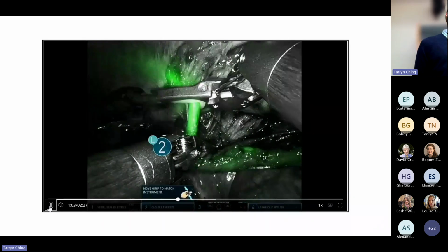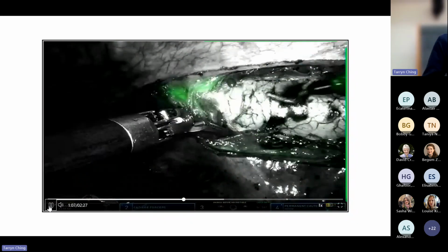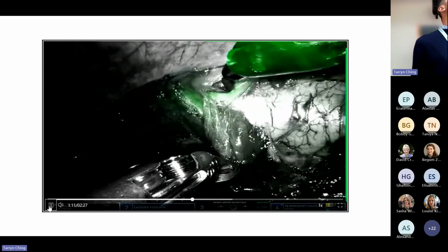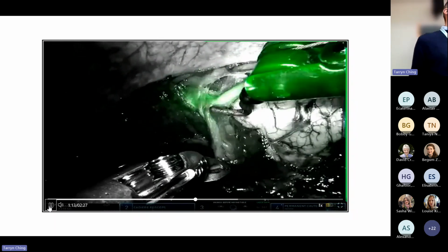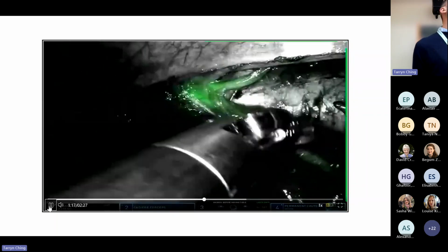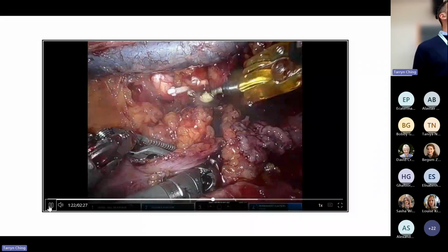This is the normal anatomy. This is the clipping of the duct in the lower part of the chest. But we know well that the anatomy of the thoracic duct is variable, is inconsistent. This is the first of the accessory ducts that I've seen. We are in the lower part of the chest, and you can see a nice duct that cuts across.